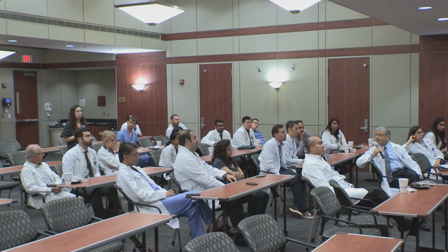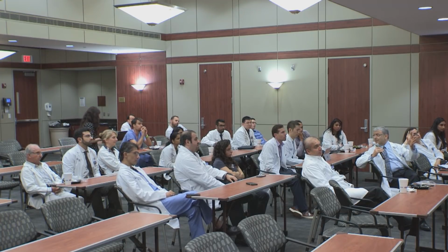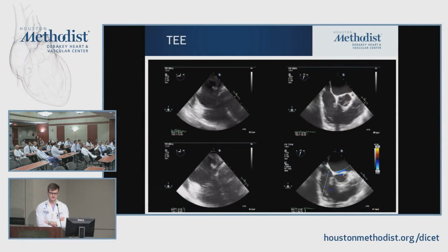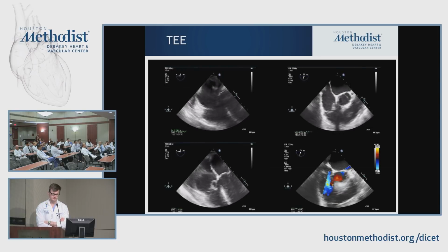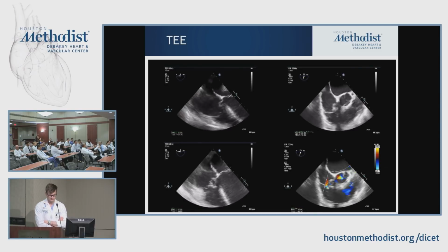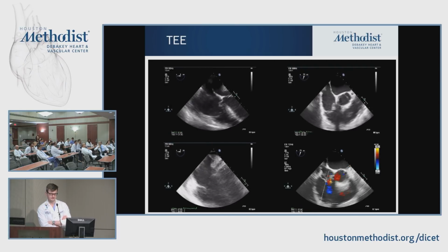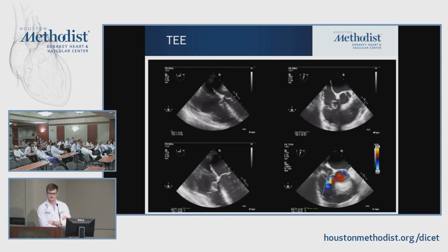Yes. Saline contrast, doesn't have to be anything else. Saline contrast. Why? Because if this is a deformation of the tricuspid septal leaflet that is wrinkled and pushed back into the right atrium, it's going to fill with contrast. If it is on the left side, protruding, either a sinus of Valsalva aneurysm, which happens in those situations, or a septum that is infected and communicating with the left side, then you won't see it.